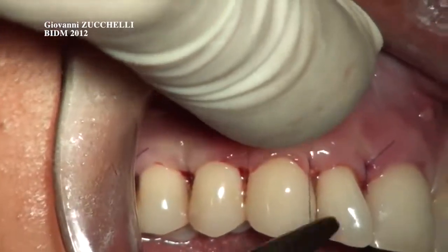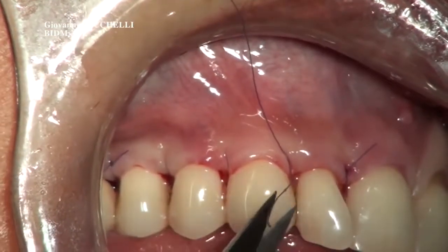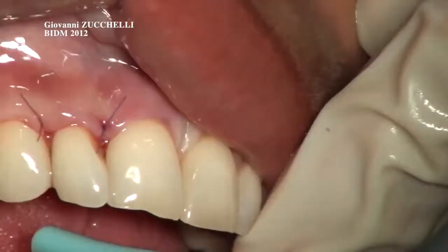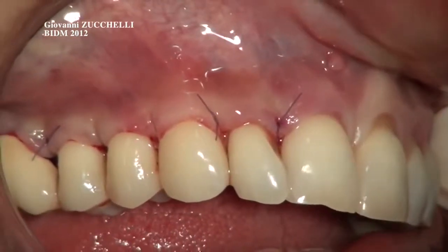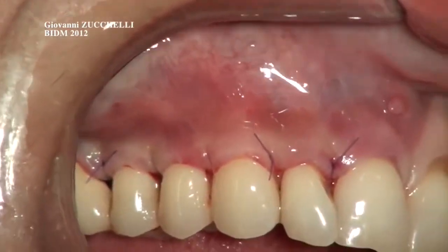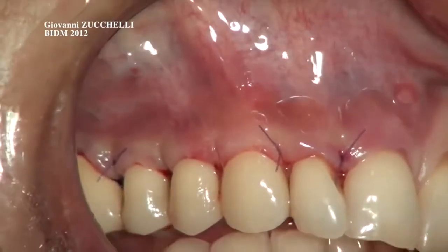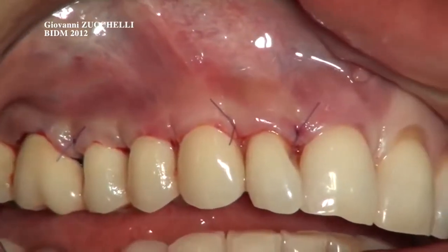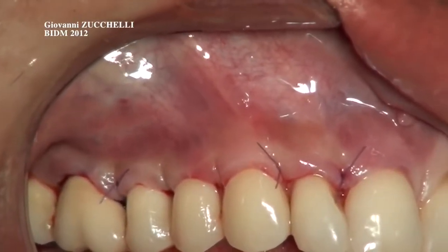And the most important thing is to obtain really a marginal fit between the keratinized tissue of the flap and the convexity of the clinical crown. Now I will tell you what it means. So we go back to the position. Okay, you will see that all keratinized tissue now, close it, okay, is placed above. I don't want to see the tongue. I hate the tongue. Now it's perfect.